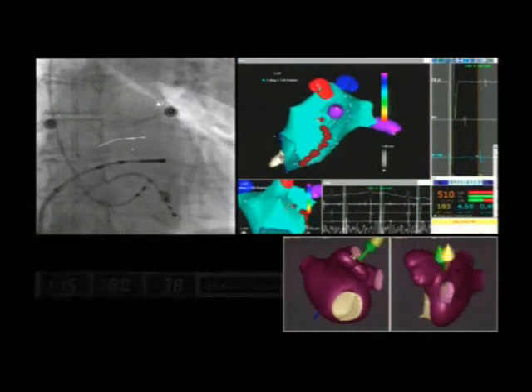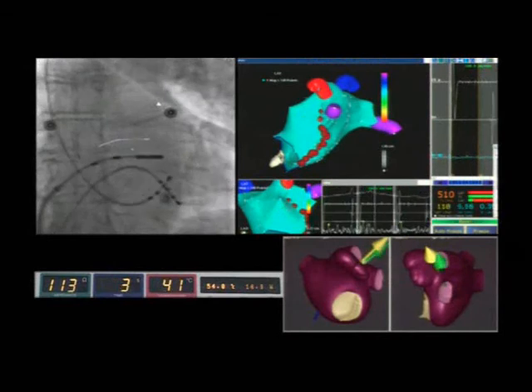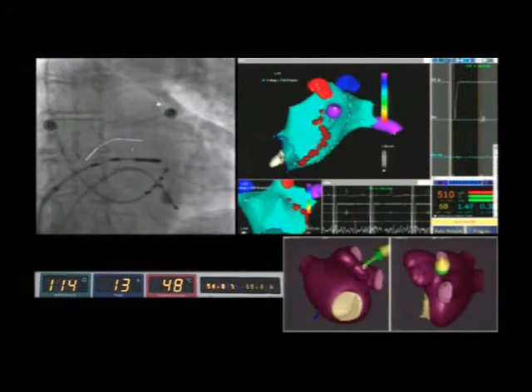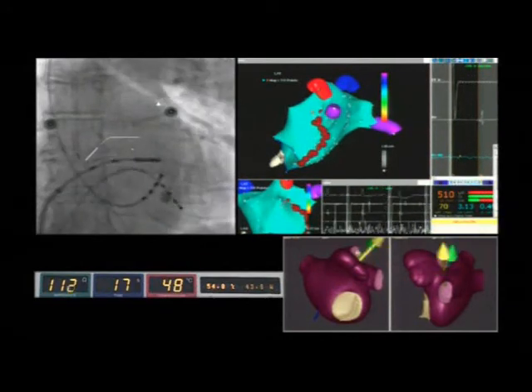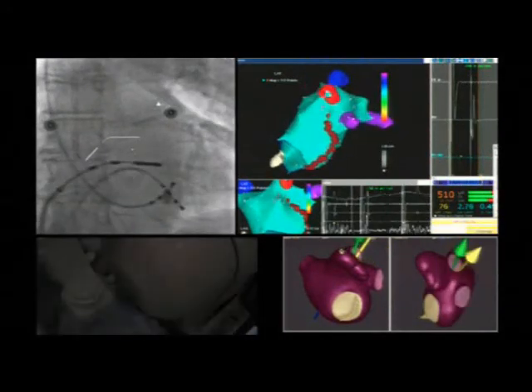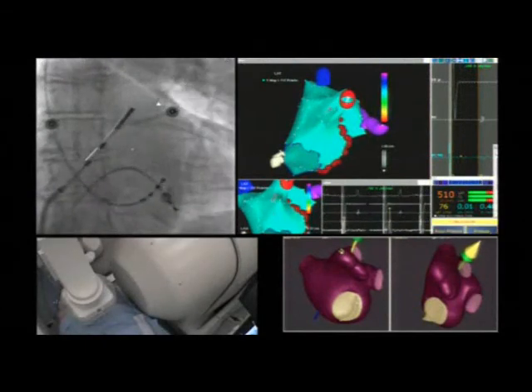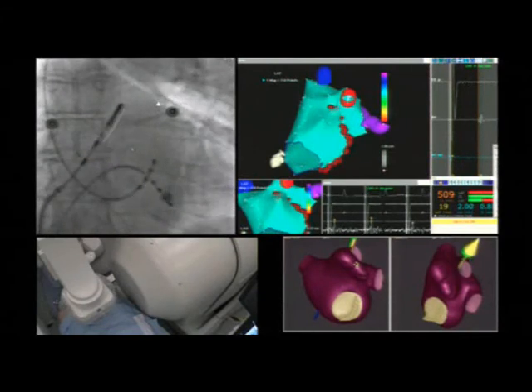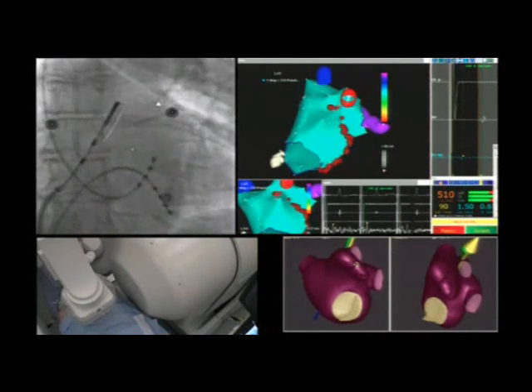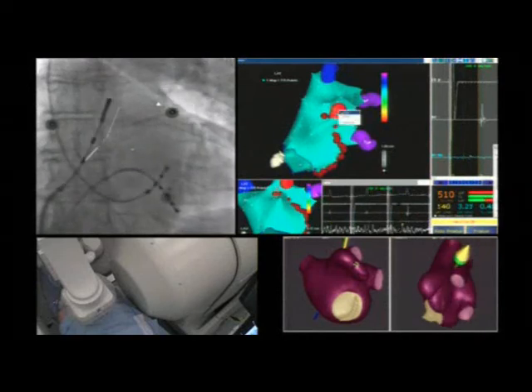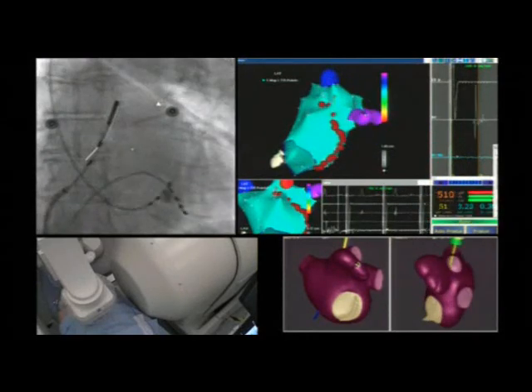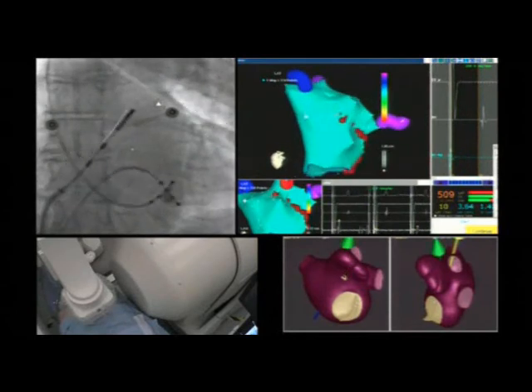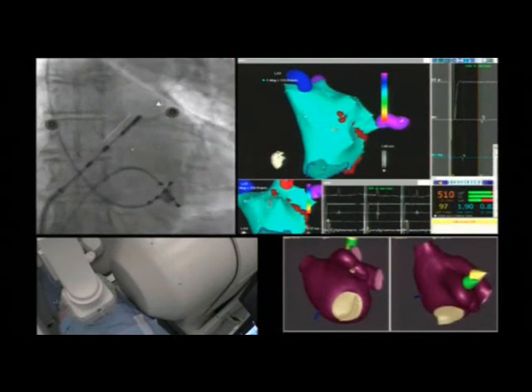Circumferential pulmonary vein ablation is performed with a target temperature of 65 degrees Celsius and a power limit of 50 watts. These values can be varied based on the area of the atrium that is being ablated. The left inferior pulmonary vein was reached. The left superior pulmonary vein, shown in red, was removed in order to allow the operator to see better the area around it.